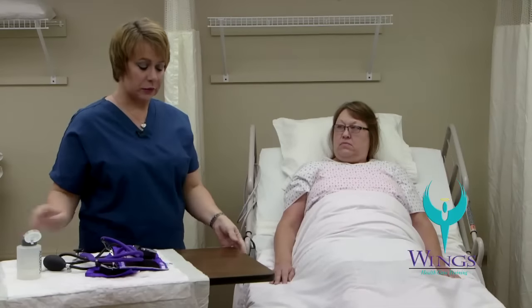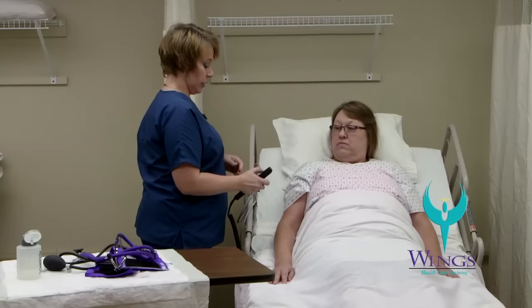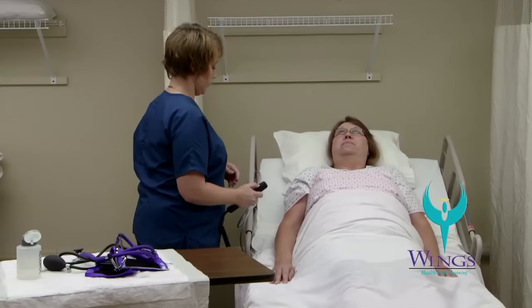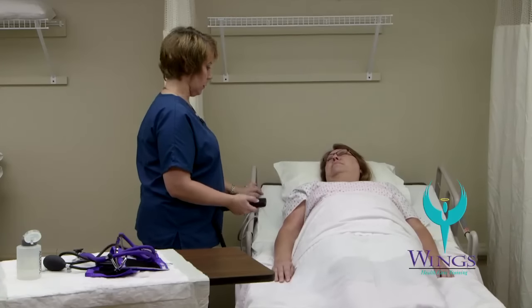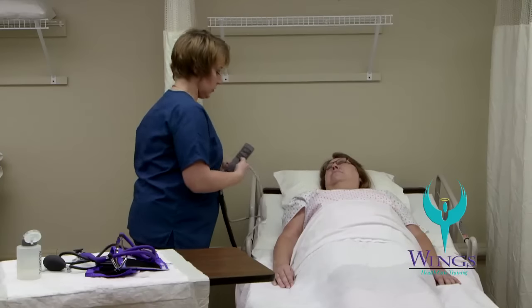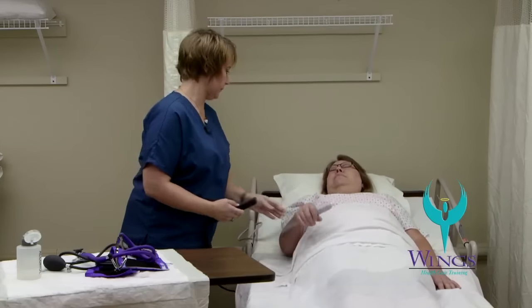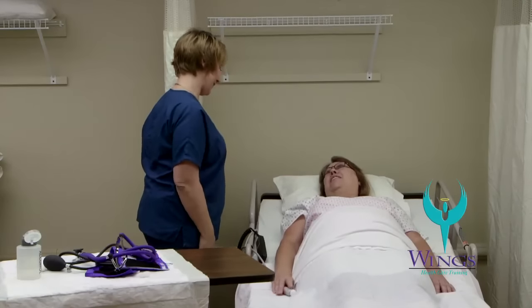Now I will clean up the rest of my supplies and make sure that I've repositioned Beth for comfort. The head of the bed should be at 30 degrees. The side rails will be up if they're ordered. Returning the bed to the low position and making sure that Beth has her call light in reach. Are you comfortable, Beth? I am. Thank you. At the end of the skill, record and report.